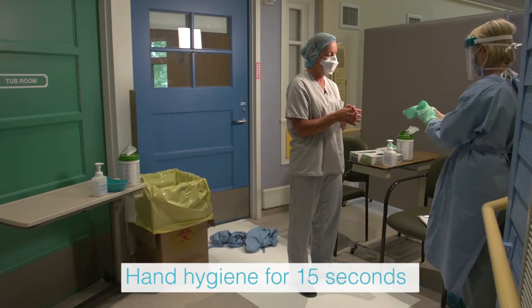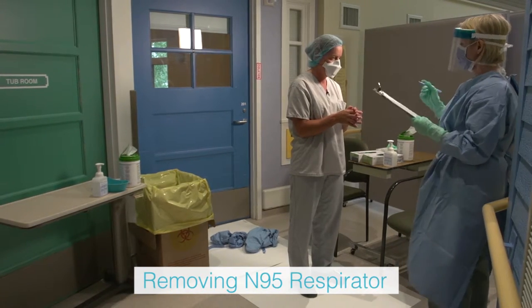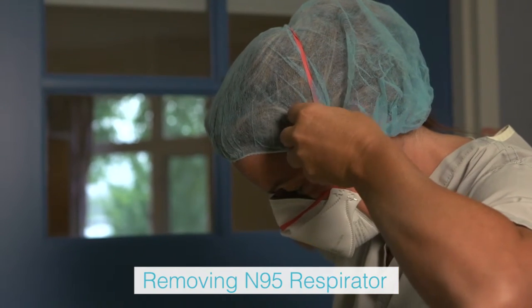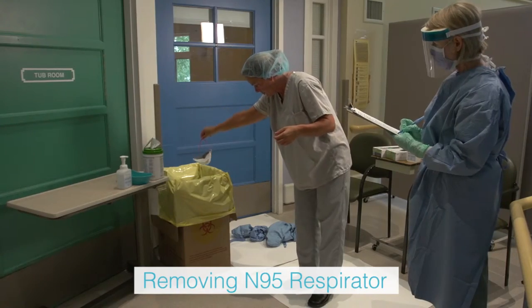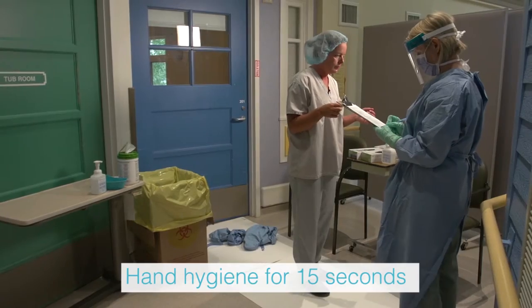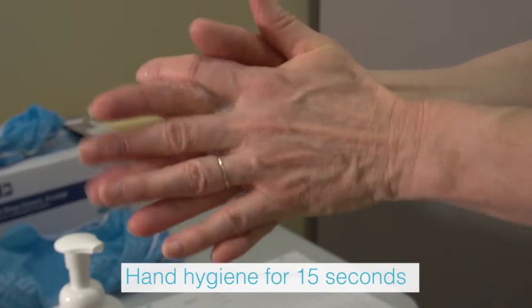The health care provider removes the N95 respirator by handling only the back straps, as the front of the respirator is considered contaminated. The bottom elastic is lifted over the head first, followed by the top elastic. The mask is removed by pulling it forward off the head and bending forward, allowing the respirator to fall away from the face. Place in the waste receptacle. Perform hand hygiene using alcohol-based hand rub and allow hands to dry completely.